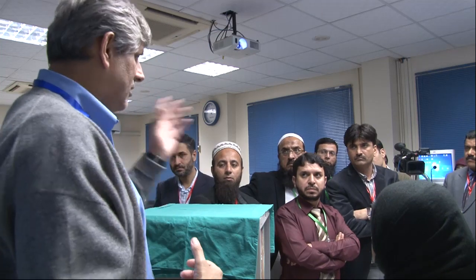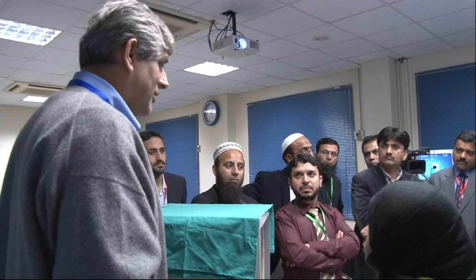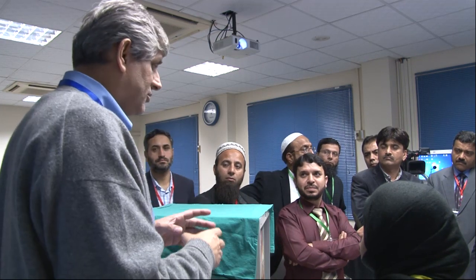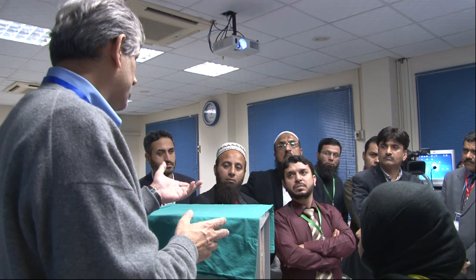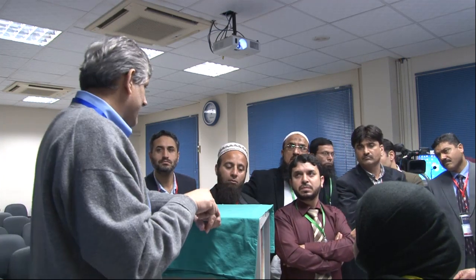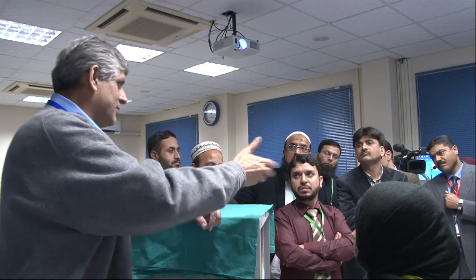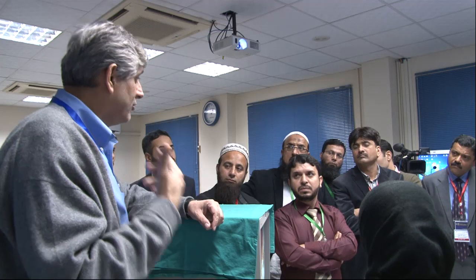The patient is doing, especially if it's a sedated patient under propofol, and you pray to God that you haven't actually stretched the stomach too much. But that is a very important movement. We'll try and show it to you. That makes it very easy to get that sunset sign. And once you've got that, then it's a piece of cake reducing the scope. It's very important to learn to reduce the scope.